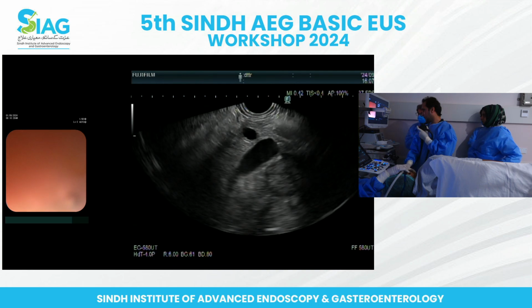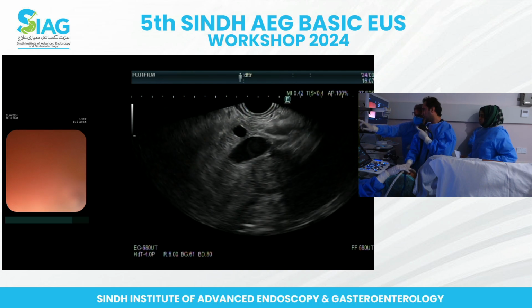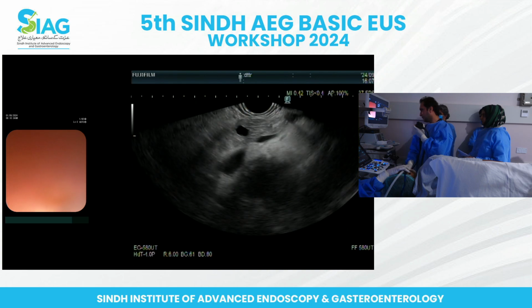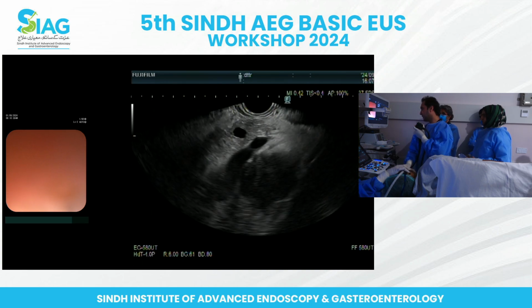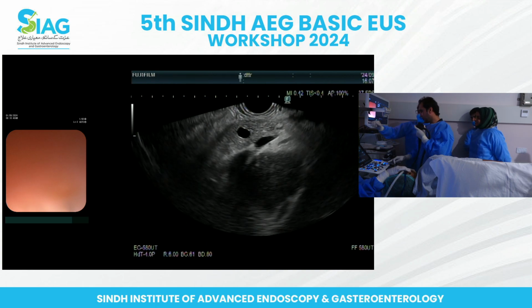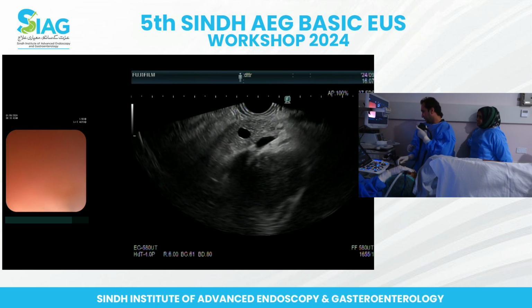We haven't quite seen the mass in the head yet, have we? And this is a small bowel coming, yeah? That's the mass. You just saw the mass. There it is. And that's in the head, yeah? Do you guys understand what's happened here? Should we measure it from this here as well?